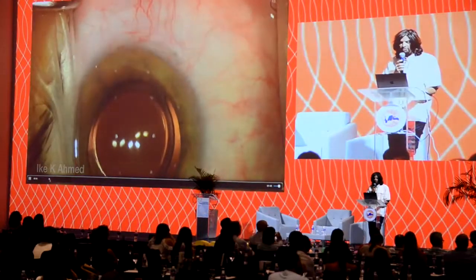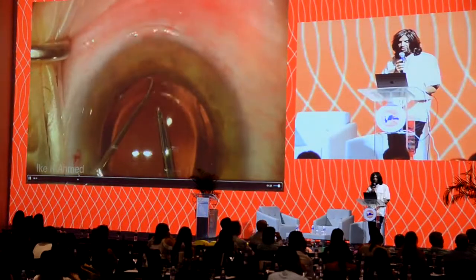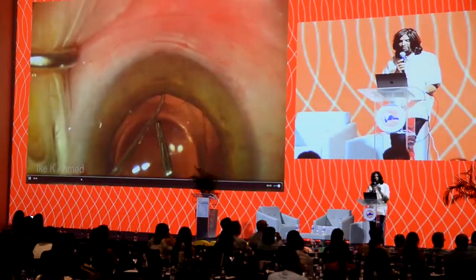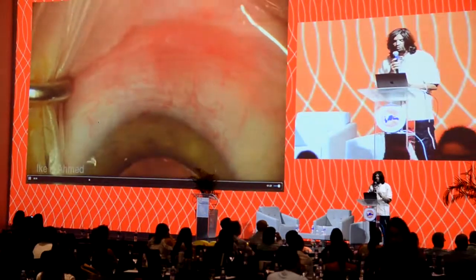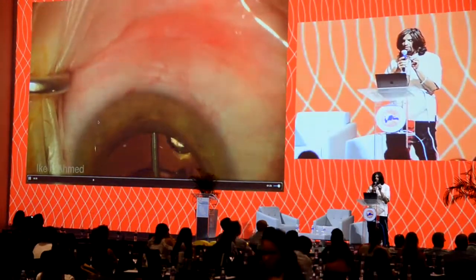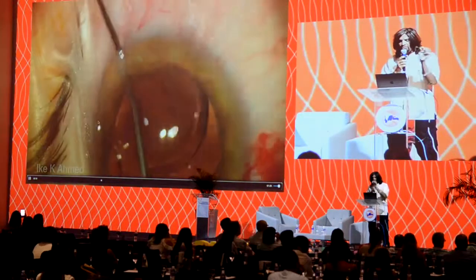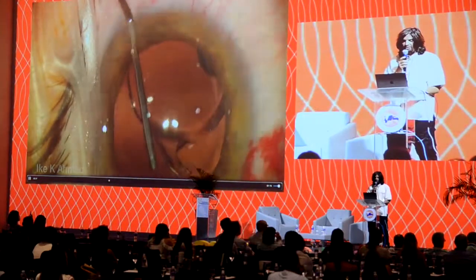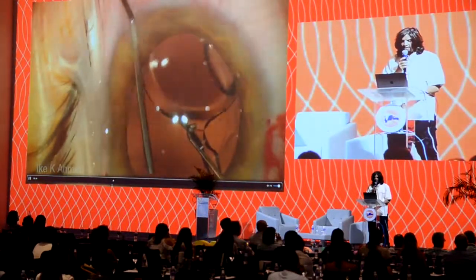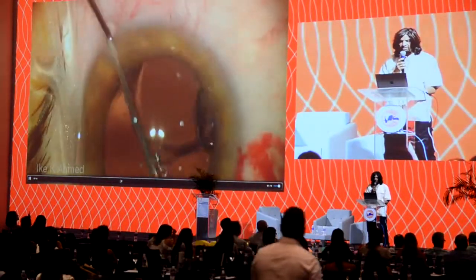Here again, we could all do small incisions. This is a bit longer post-operatively, so we're going to use the Sinskey hook and a pair of micro forceps. The forceps hold the anterior capsule. It is rarely a difficult problem to lift off the capsule from the lens. Now here I'm injecting a little bit of viscoelastic just to kind of free up the haptic, both along the nasal and the temporal side. And again, as long as the capsular bag is not mobile, we can typically inject viscoelastic.